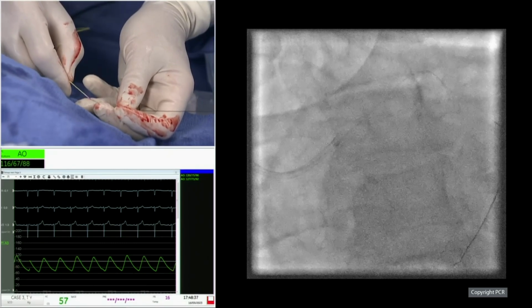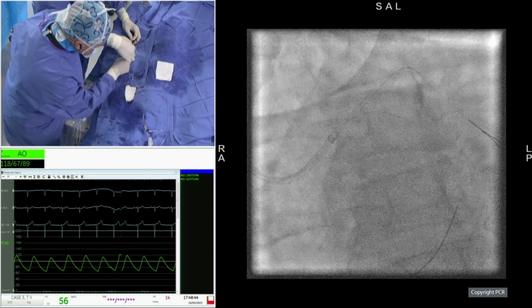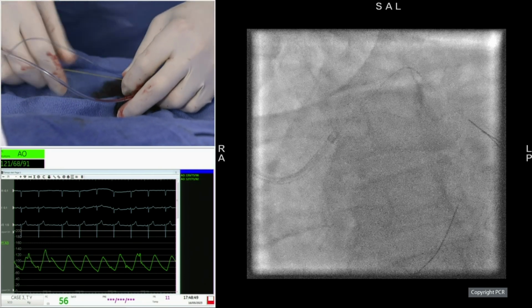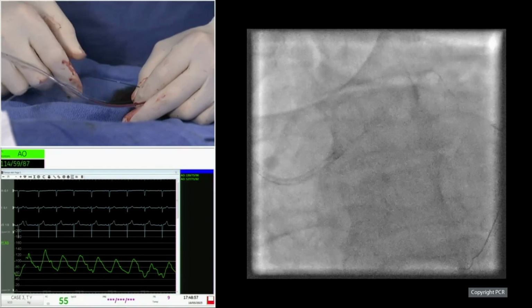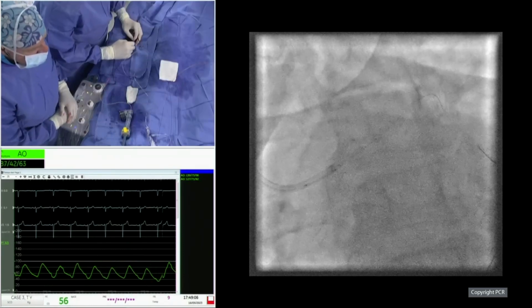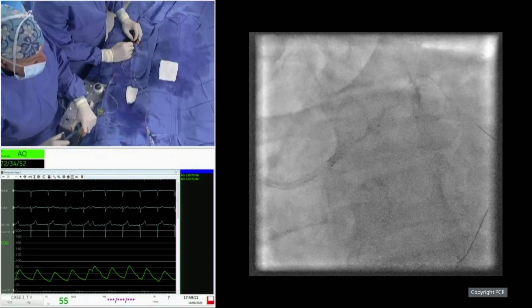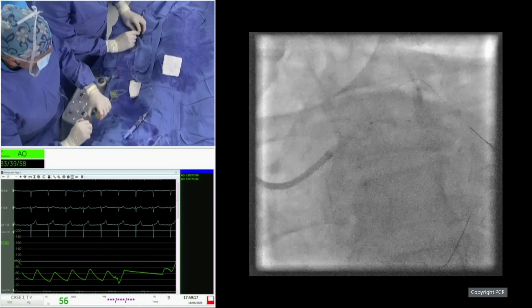Sorry, my eyes are now too old. Okay, it's okay. You have seen all the possibilities of opening a distal or proximal cell, and then you can eventually create a new metallic carina, and to rewire that or to cross with a balloon is not an easy thing. People want to use a drug-coating balloon after stenting. Bruno Scheller will tell you, be careful, because the struts are going to scrape the coating and the drug from the balloon. So there is still a lot of work to be done. But we are pleased to see that it is crossed now.